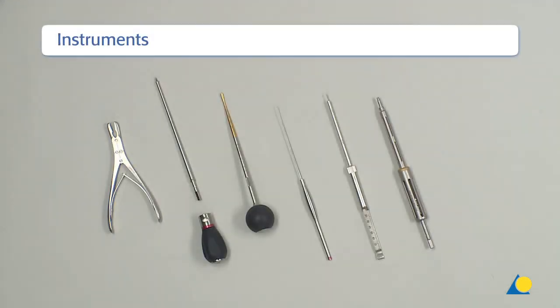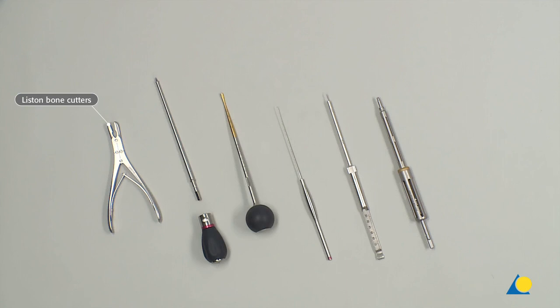Pedicle screw placement. The required instruments for screw placement are the Liston bone cutters, the pedicle awl, the teardrop handle, the pedicle probe with spherical handle, the ball tip feeler, the depth gauge, and the quick connect polyaxial screwdriver.